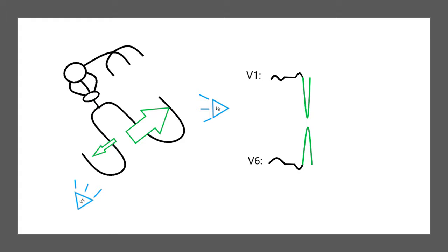Okay. Now newborns and infants, if you do ECGs on them, and maybe I'll even discuss that in a later episode, have different ECG patterns, and that's because when you're born, your right ventricle and left ventricle are more equivalent in size, and as we get older, our left ventricle gets bigger and bigger, and so it dominates what you see on the ECG. And so adults are left ventricular dominant organisms, and so what you typically see is left ventricular activity only.